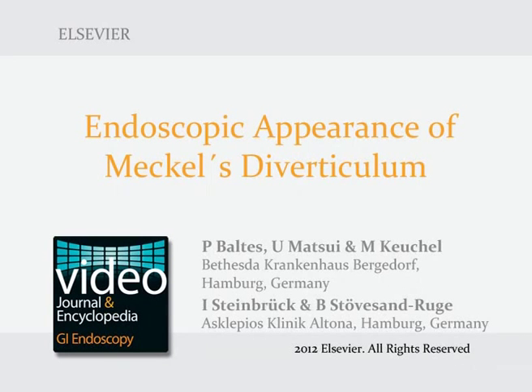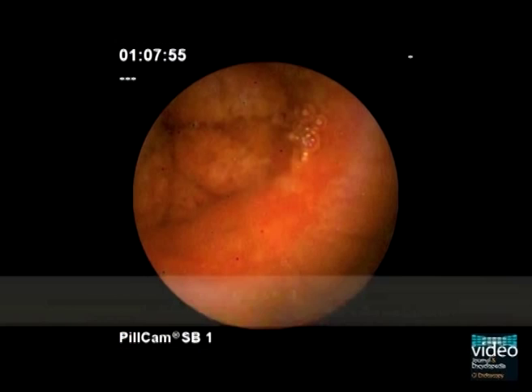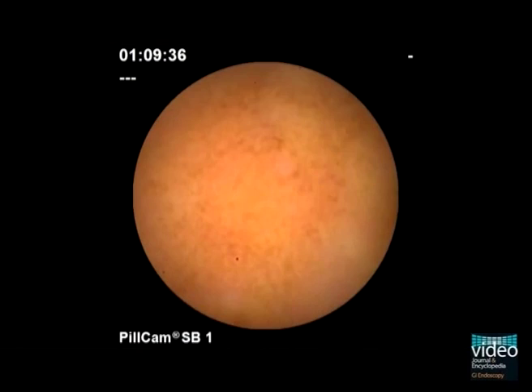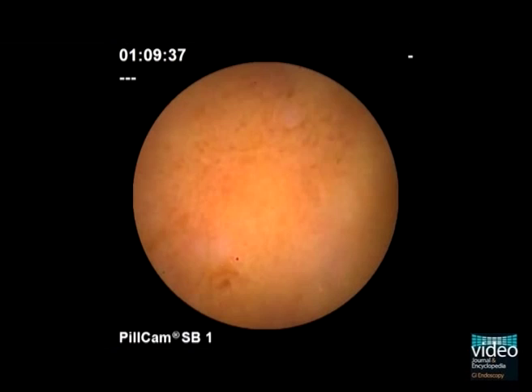Meckel's diverticulum is typically located 40 to 100 cm proximal to the ileocecal valve. Capsule endoscopy in this 23-year-old patient with mild iron deficiency anemia shows the entrance of a Meckel's diverticulum. The bridge between the small bowel lumen and entrance is thickened with ulceration. The capsule presses against the entrance of the diverticulum with short glances into the lumen.